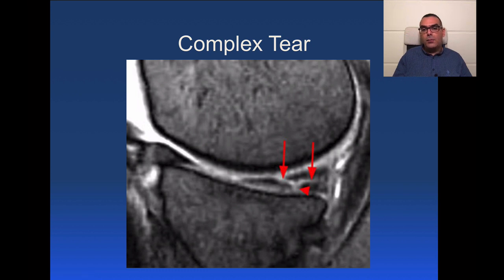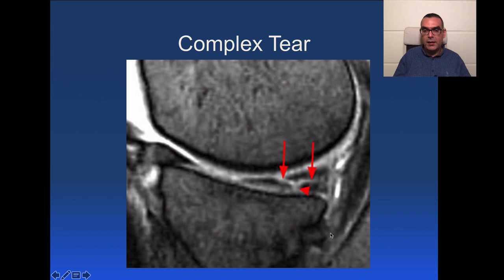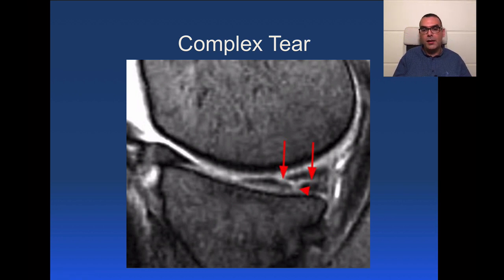Complex tears have both horizontal and vertical components. You can have a horizontal combined with a vertical longitudinal or vertical radial — branching and mixing. When you see a horizontal component and a vertical or oblique component passing through both surfaces, call this a complex meniscal tear. Always clarify whether the edges are clear or macerated, note any meniscal fragments, whether the meniscus is amputated, and any intraarticular loose bodies.